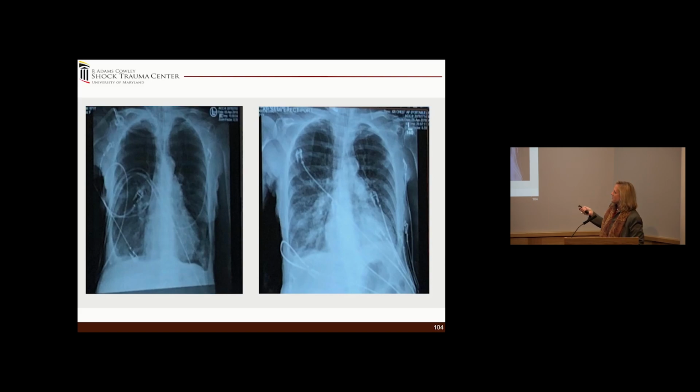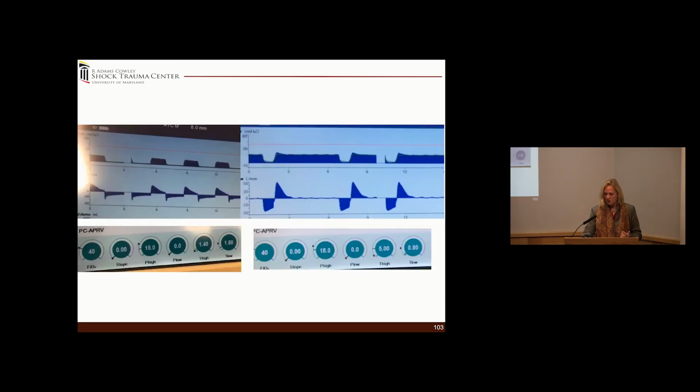And then when she receives fluid, had bibasilar collapse, then we needed to change the settings. So again, look at the peak expiratory flow rate. It's not even 20 liters, and it's very flat. And then here it almost doubled. It almost went up to 40, and then the T low had to change. So very different. And again, you can assess that, which I don't have, unfortunately, is that when it went to 40 liters and all the way to 0, the angle was much steeper.